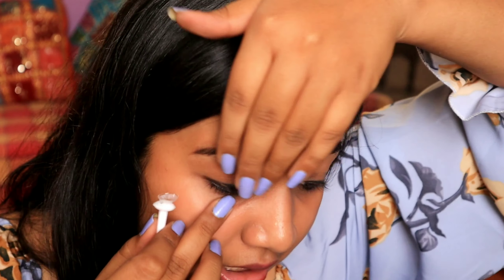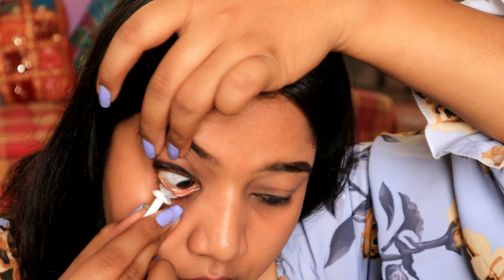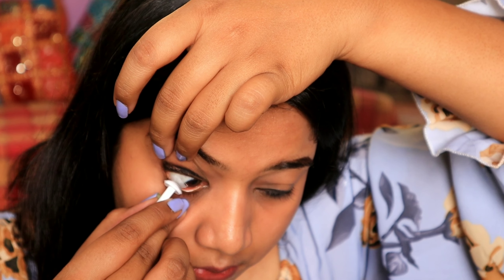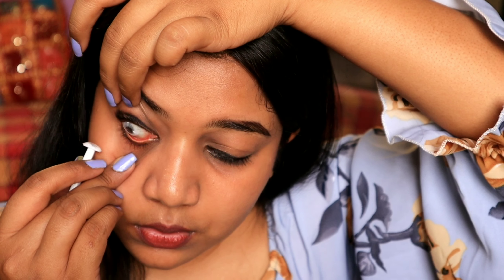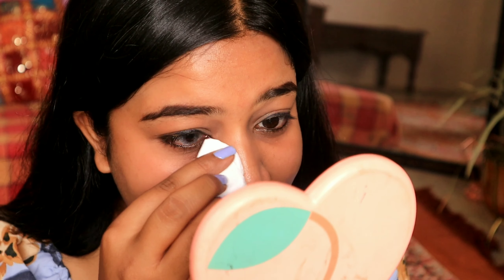Let's start with this eye because I don't quite understand it yet. Oh my god — it's so much faster, wow! Oh my god, it's so comfortable! I don't look like anything else — wow, nice! Although my eyes are red, quite red now, it is looking beautiful, beautiful. I am in love with it!